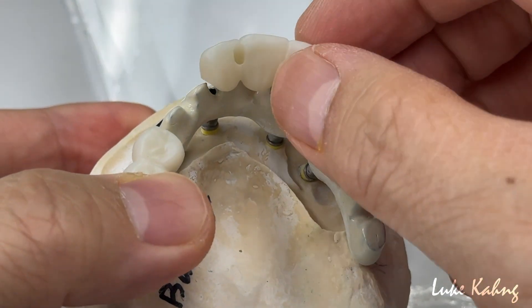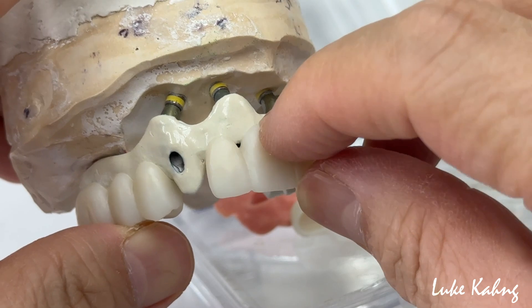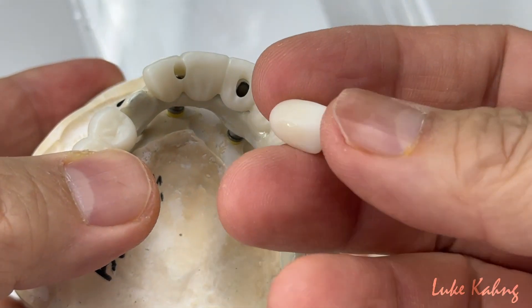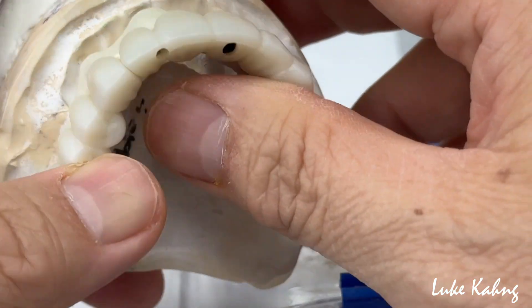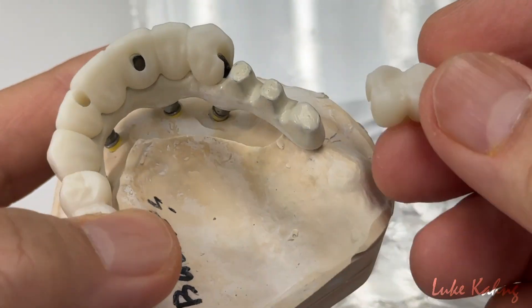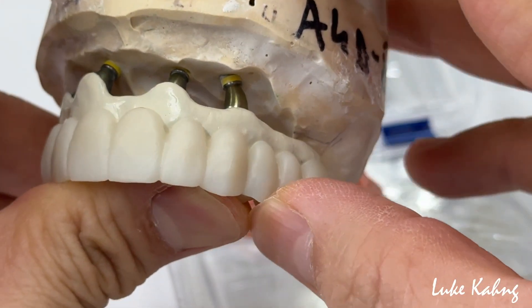First, we designed it carefully in that area. So we're going to hide it with the pink porcelain over there. We're not going to cement this yet. After we finish, just cover the hole, and just stay between the teeth and facially cover that area.